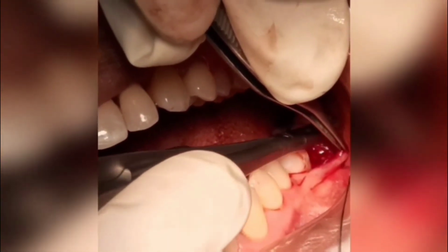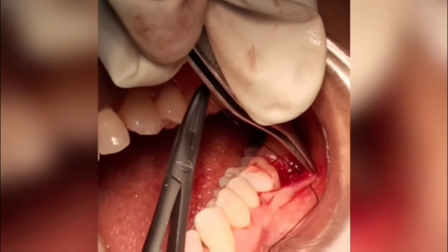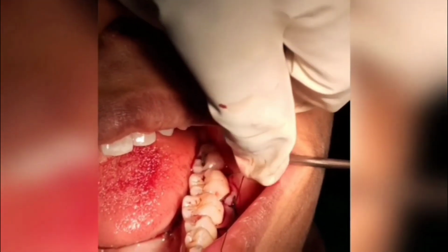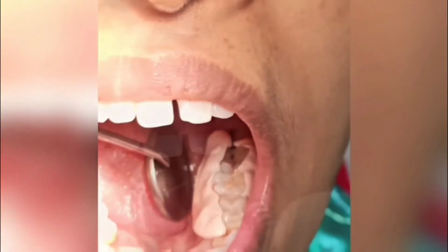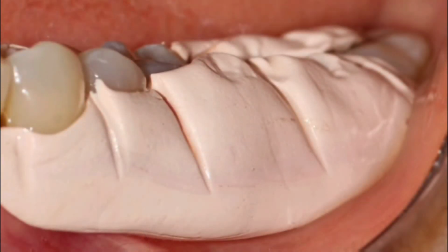A vertical mattress suture was given at the site of the bone defect, followed by indirect interrupted sutures. Coe-Pak was used as the periodontal dressing and was placed over the buccal as well as the lingual flaps.